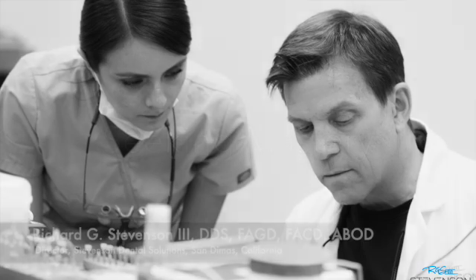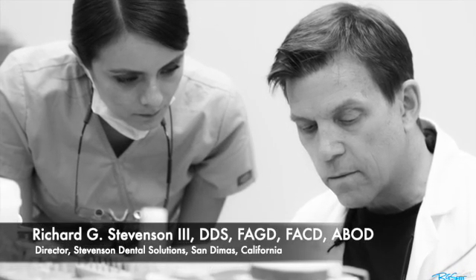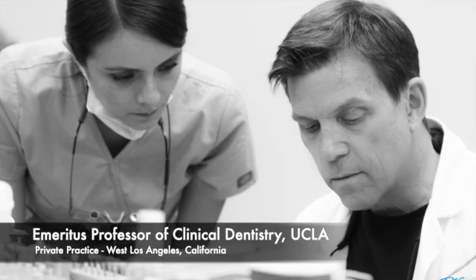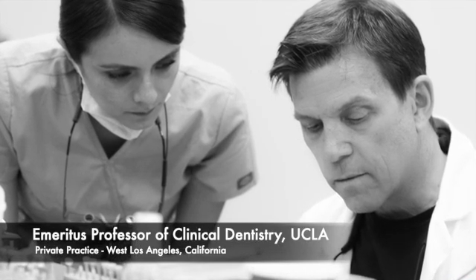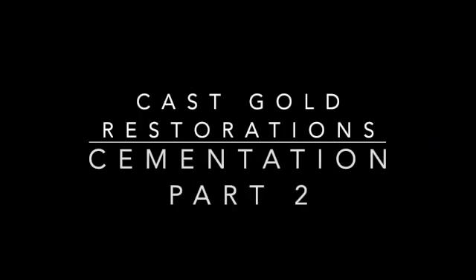Hi everybody, I'm Dr. Richard Stevenson, director of Stevenson Dental Solutions in San Dimas, California, and emeritus professor of clinical dentistry at UCLA. We have a course coming up on cast gold and direct gold every December — three days, hands-on, it's an amazing course and it will sell out. Today we're going to finish up the cast gold cementation quadrant by focusing on cementation, finishing, and polishing.